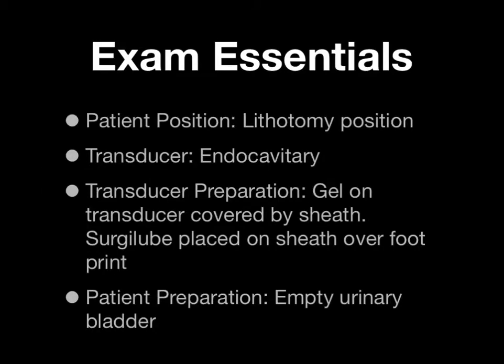To perform the endovaginal exam, you want to make sure that the patient is in the lithotomy position. This is going to allow you to move the handle of the endovaginal transducer up and down. If you've got the patient flat on a cart, you're going to be limited in your ability to perform the exam. The exam is going to be performed with the endocavitary transducer.